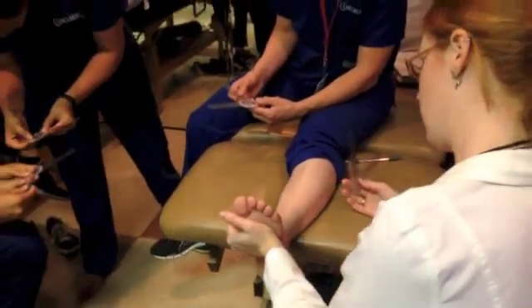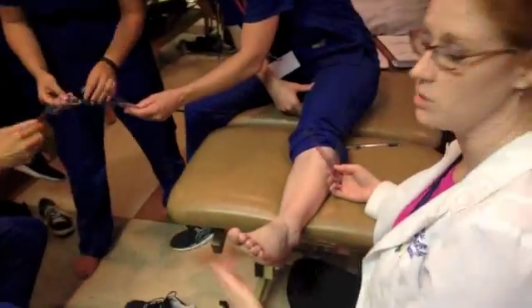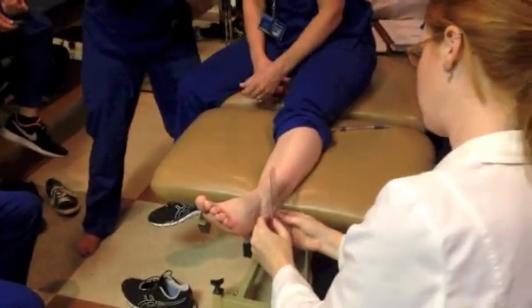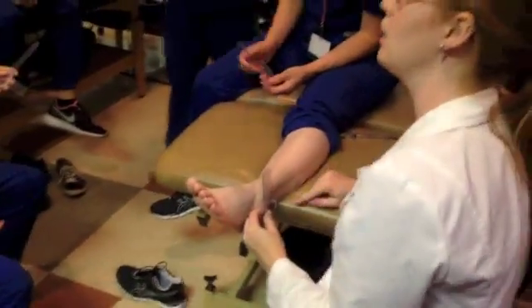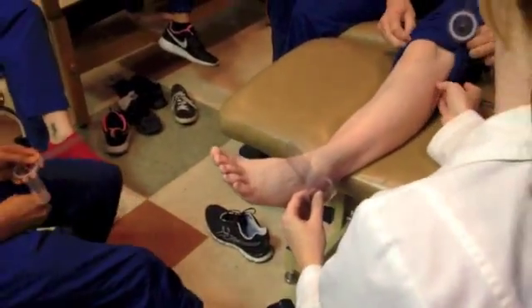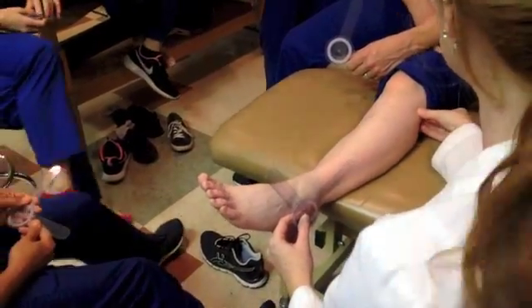Our fulcrum is the lateral malleolus, so you're going to be on the lateral side of your patient. I'm going to take my fulcrum to the lateral malleolus. Now my stationary arm is going to line up with the lateral midline of the fibula, and I have to make sure that it points all the way up to the fibular head, which we haven't really palpated yet, but it's up here.